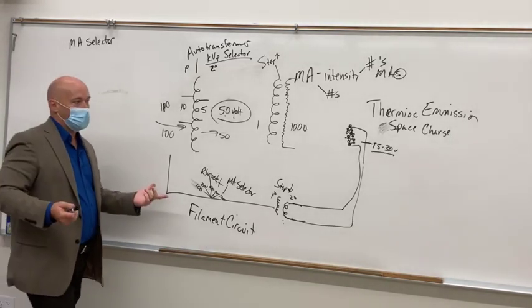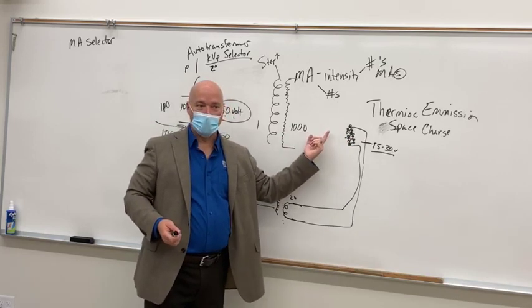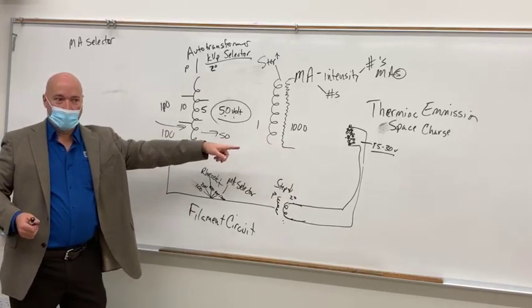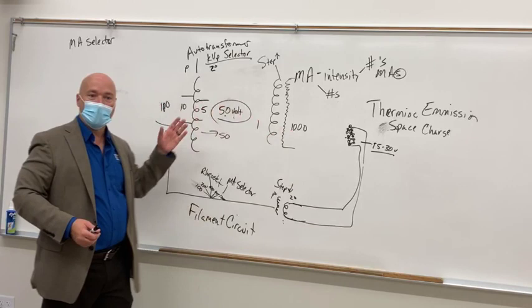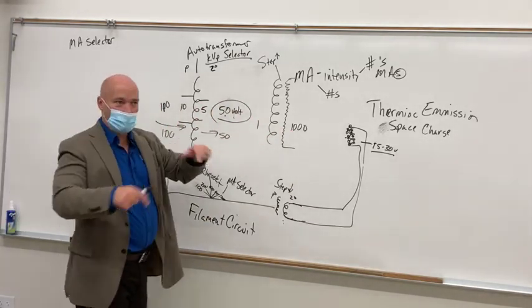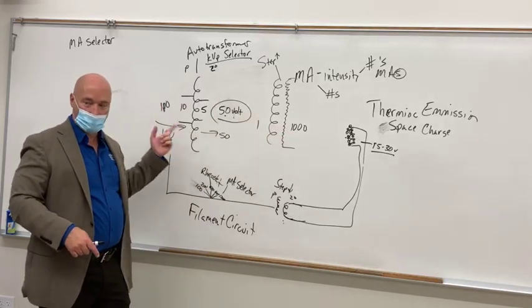Well, if 440 volts is going to create a spark when you put two things close enough together, do you not think 50,000 volts would? Absolutely. So it's dangerous to work with at kilovoltage rates. You don't want to do that. You don't want to be in charge of the machine and pushing buttons that give you kilovoltage. You want to deal with low voltage.